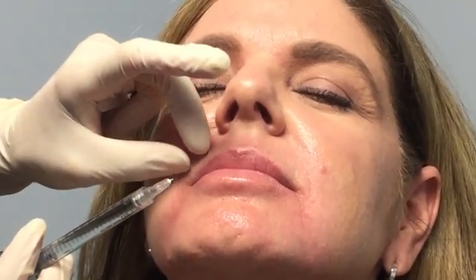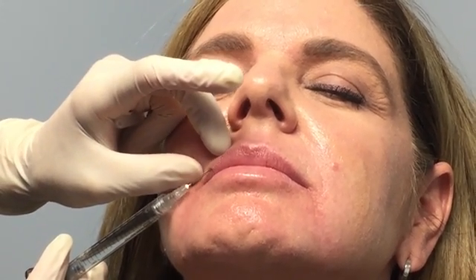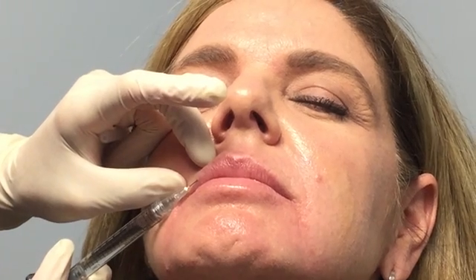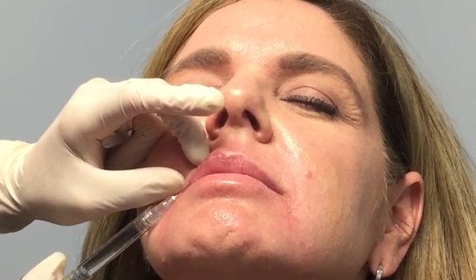I'm going to have you rest your head back a little bit so you're not moving on me as we start doing the lip injection. You're going to come close so we can show a little bit. What I like to do first is always the lip border, but everybody has their own technique. I'm just going to poke right there, and we're going to go right under the border. I don't want to inject on the border itself. I just want to create a tiny definition. I inject as I'm coming back, and I don't like to inject this one too deep. I mean, too superficial, sorry, too close to the surface.